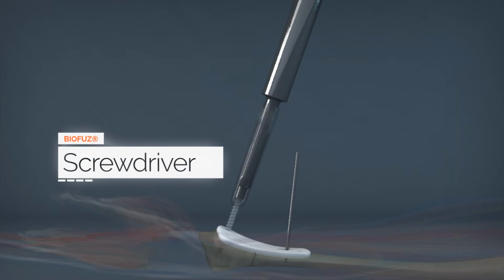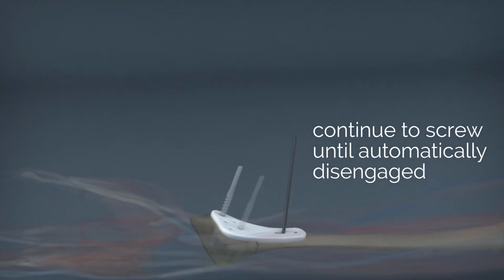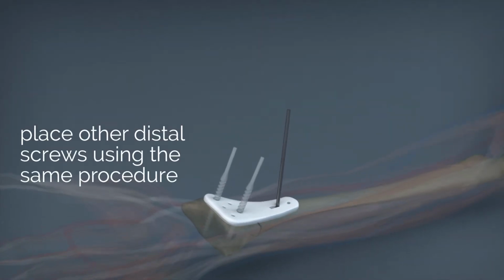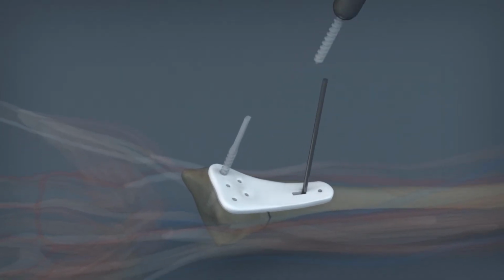Take care to insert the screw in the direction of the drill. When the tube comes in contact with the plate, continue to screw until the screwdriver is automatically disengaged. The screw is now inserted at the right depth. Place other distal screws using the same procedure. If you need to remove a screw for any reason, you can use the screwdriver.